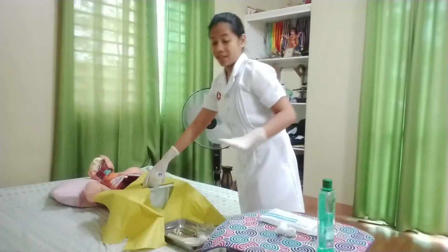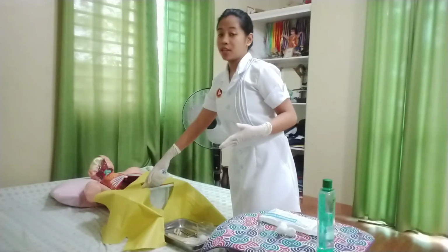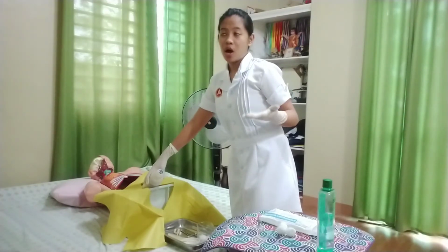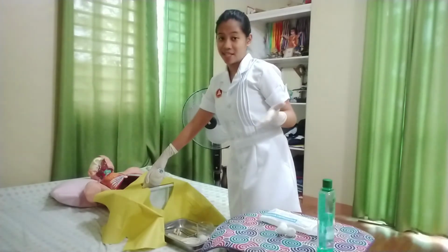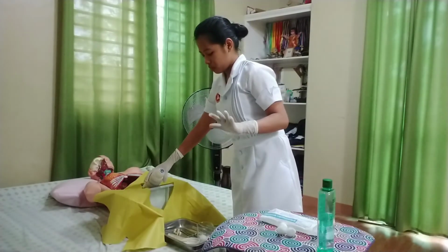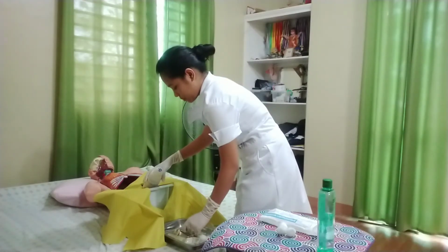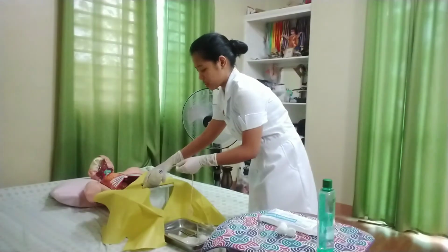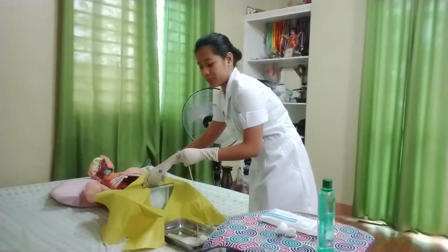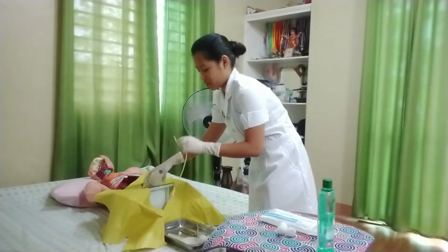Now that I'm already done cleaning the meatus, I will be positioning the penis in an upward position with a little tension and perpendicular to the client's body. And then I will be lubricating the tip of the catheter. And then I will insert the catheter into the meatus.